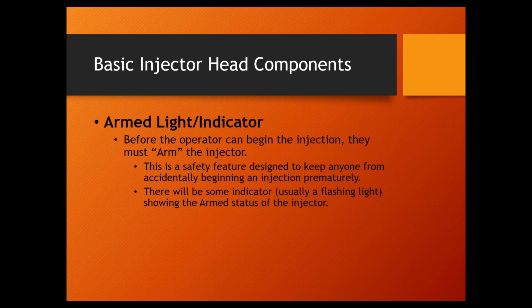What we'll do is, depending on the size of the class, we'll set up 2, 3, or 4 different injector models, and we'll break the students up into small groups. So we have one group on model A, a group on model B, C, and D, and then the next day everybody comes back and we just rotate them to the next model. Yep. And it's typically 1 day per model.